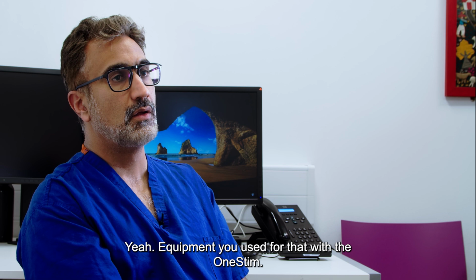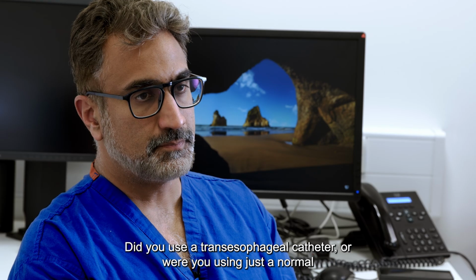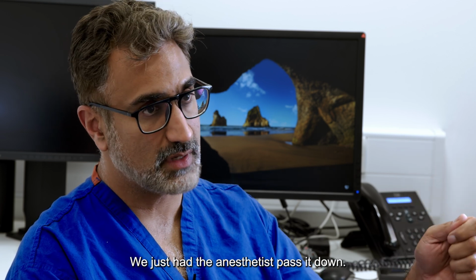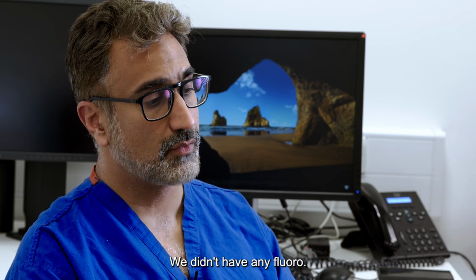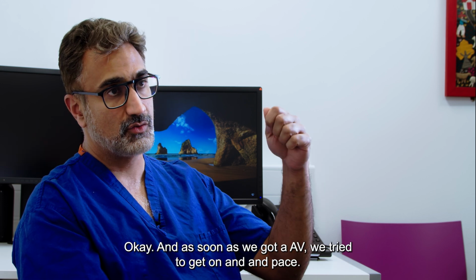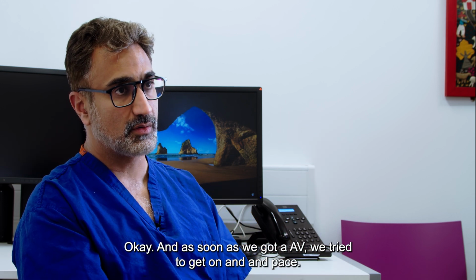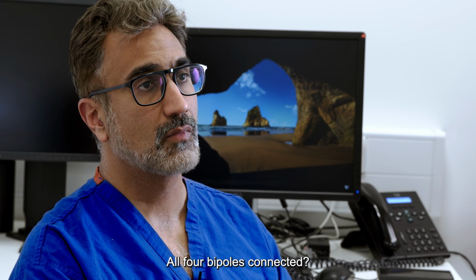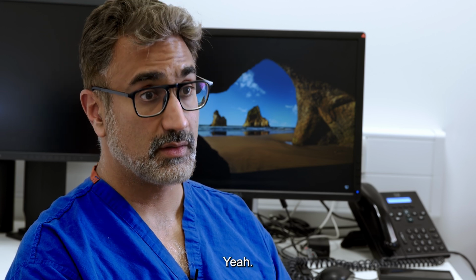Yeah. The equipment you used for that with the OneStim, did you use a transesophageal catheter or were you using just a normal one? No, so we just had the anaesthetist pass it down. Mm-hmm. We didn't have any fluoro. We simply watched to see where we got A and V. Okay. And as soon as we got A and V, we tried to get on and pace. All 4 bipoles or all 4 connected? Plugged in. Yeah. Yep.